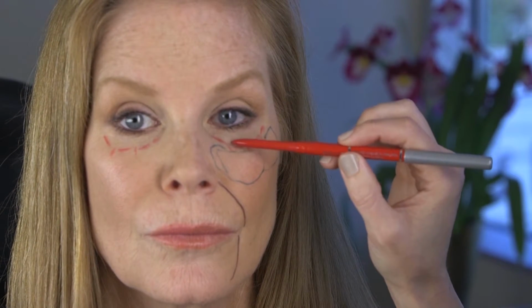So in the tear trough primarily, we use Restylane Silk. We use those products primarily because they're less hydrophilic in terms of hyaluronic acid-based fillers. They're less likely to bind water so readily, so they don't have a tendency to get puffy. Since the under eye area skin is very thin, we don't want puffy under eyes as a result of trying to correct one problem.